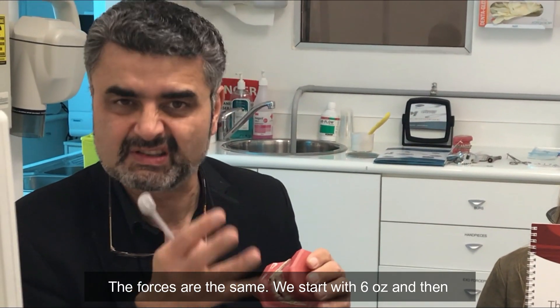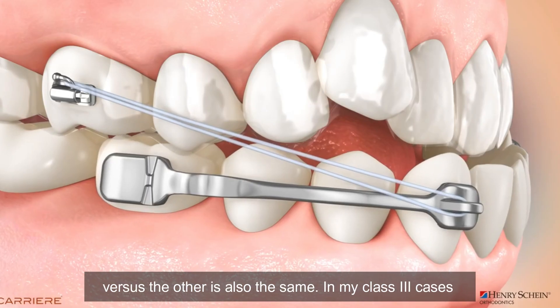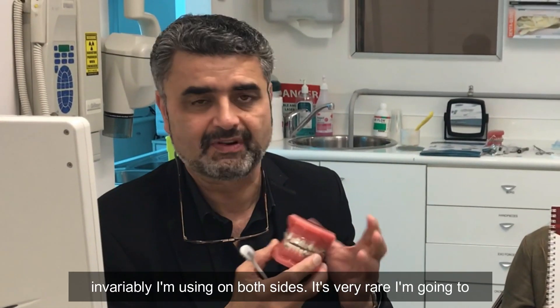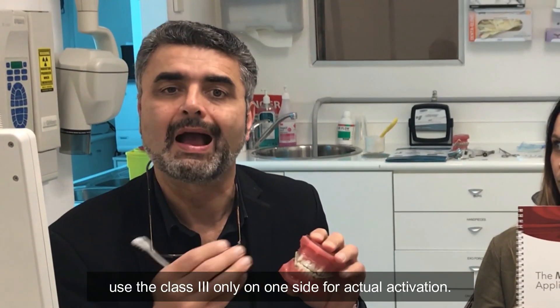The forces are the same — we start with six ounce and then move on to eight ounce. The concept of driving on one side versus the other is also the same. In my Class 3 cases, invariably I'm using it on both sides. It's very rare I'm going to use the Class 3 only on one side for actual activation.